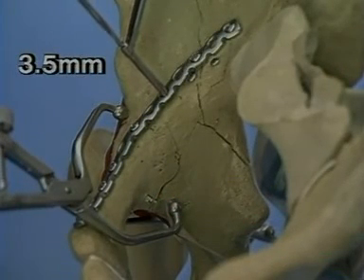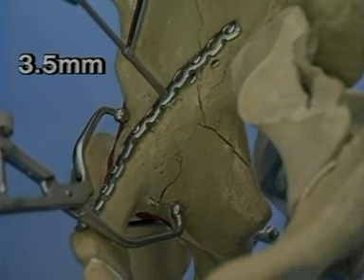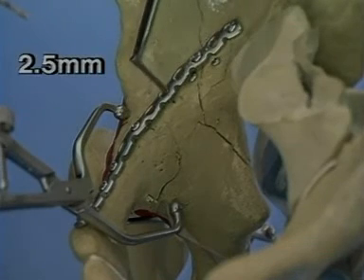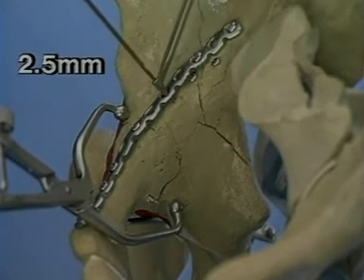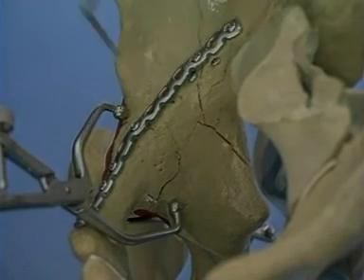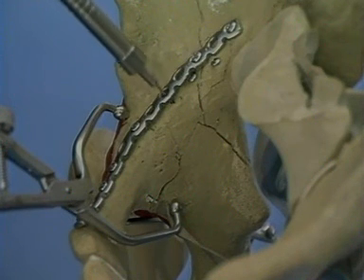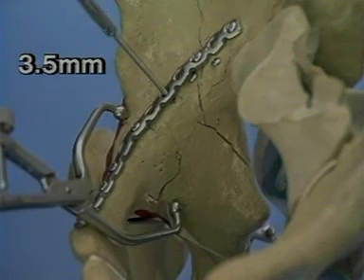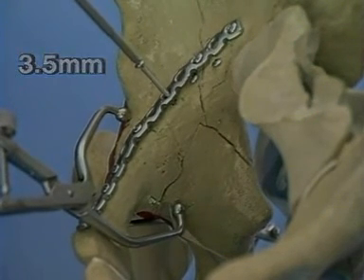3.5 millimeter lag screws are now placed through the plate holes into the posterior column. These screws must closely parallel the quadrilateral surface in order to avoid entering the joint. The 3.5 millimeter drill bit is first used for a gliding hole, followed by the 2.5 millimeter drill bit. The depth is measured and the screw inserted. The path of the screw is slightly proximal and medial to the joint.